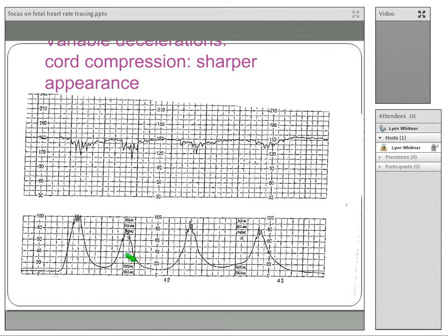If we go 1 minute, oh, this is a minute here, I apologize. Let's see, 1 minute, 1.5 minutes. From the start of here, 1 minute and almost 2 minutes. So 1 to 2 minutes apart are these contractions. They're a little bit close together, but again, she's pushing now. Baby looks like he's coping fine with it, so I'm not too concerned.